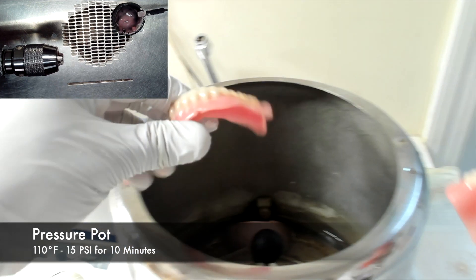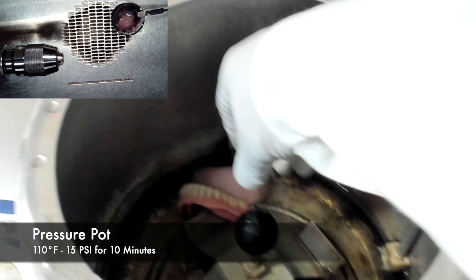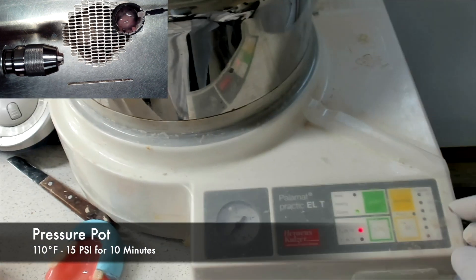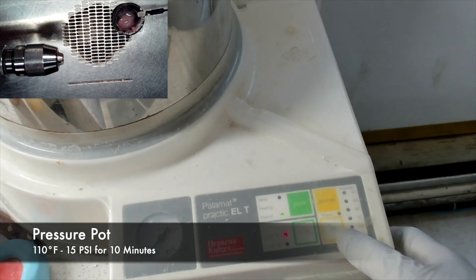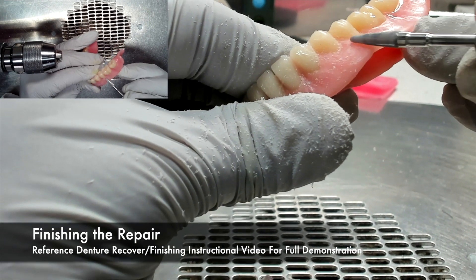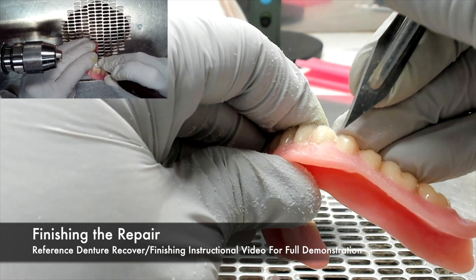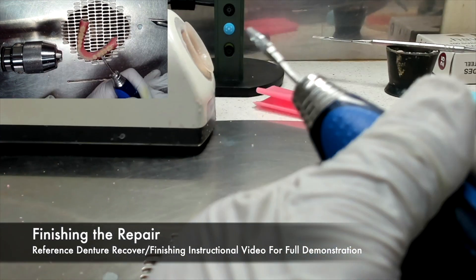Once the acrylic work is complete, you can place the denture into a pressure pot that has 110 degree Fahrenheit water at 15 pounds per square inch of air pressure for 10 minutes. Once the repair acrylic has completely polymerized, you can remove it from the pressure pot and begin the finishing. The finishing procedures are exactly the same as finishing a complete denture straight out of processing. You can reference the denture recovery and finishing instructional video for a full demonstration.